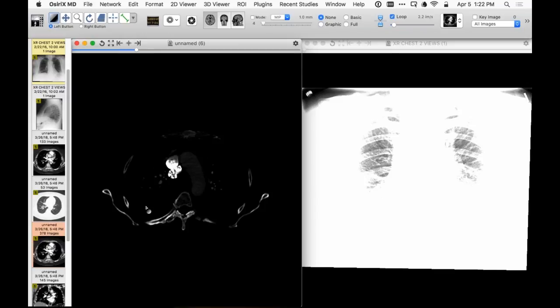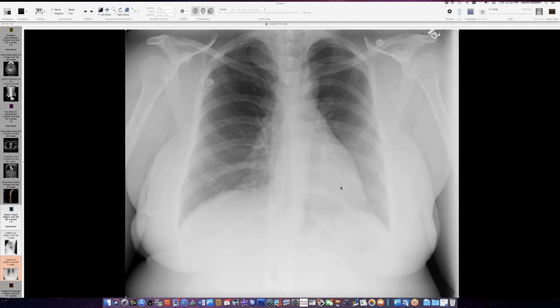Anyone? I have a quickie or two. Can people see a roentgenogram of high quality? Okay, it's a snap. This person has an apical mass here on this chest radiograph — very smoothly, very well-defined, very smooth, abutting the spine. It's like a neurogenic tumor to me. Notice that the trachea is a little bit displaced to the left.